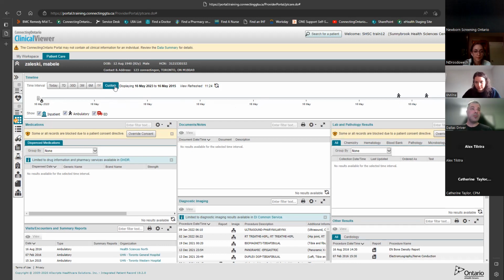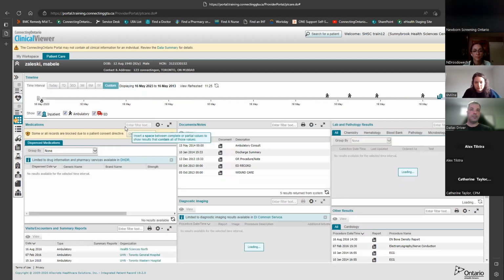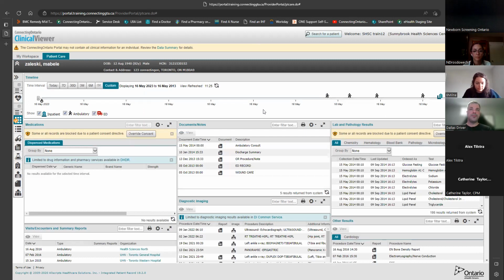And we might have to go back a little bit further because I don't see any of the lab results. There we go. All right.